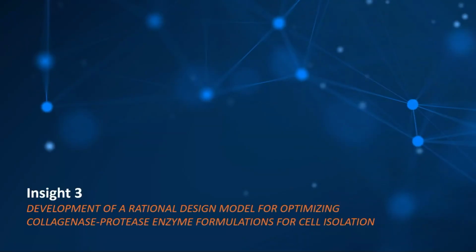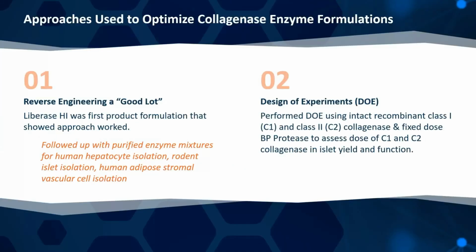The third and final insight is the development of a rational design model for optimizing collagenase protease enzyme formulations. So, a little bit of history. Two approaches have been used in the past, and to be blunt, you have to have a company to work with you to take either approach. I've already shown you reverse engineering of a good lot by Liberase HI, and I just shared with you what we did to develop a human hepatocyte formulation.